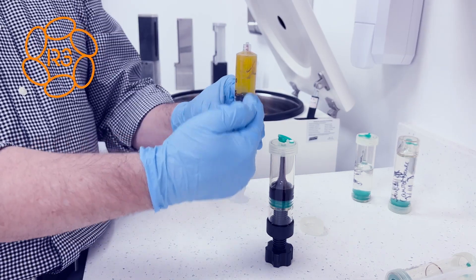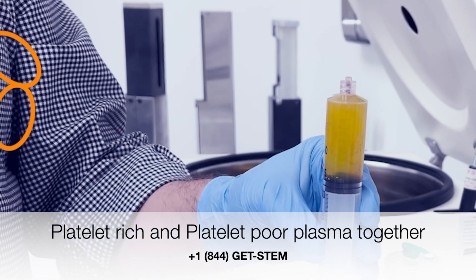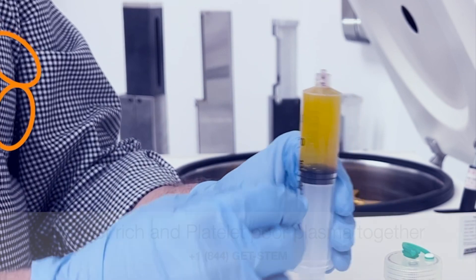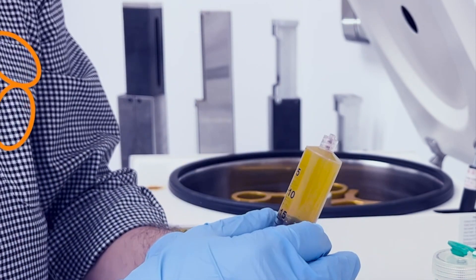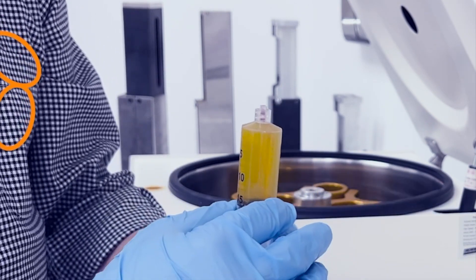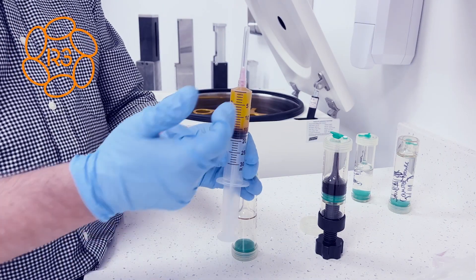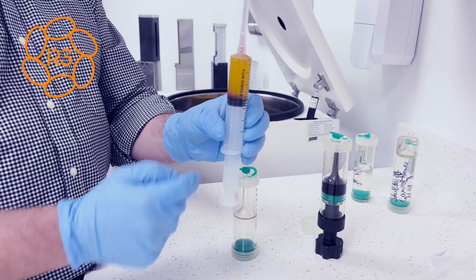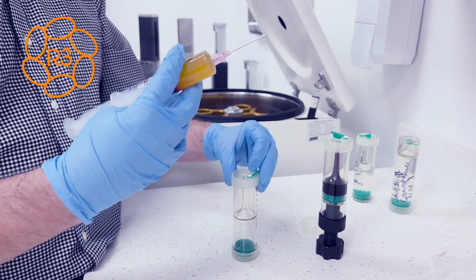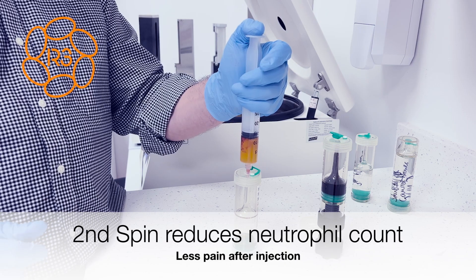So this is our PRP plus our PPP together. Now I'm going to do a second spin to really concentrate the platelets and also lower the leukocyte count — the white blood cell count — so that it won't hurt as much today, tomorrow, and whatnot. This is the PRP and PPP combination with a few red blood cells in it. What I'm going to do is prepare it for a second spin by putting the fluid into a second kit.